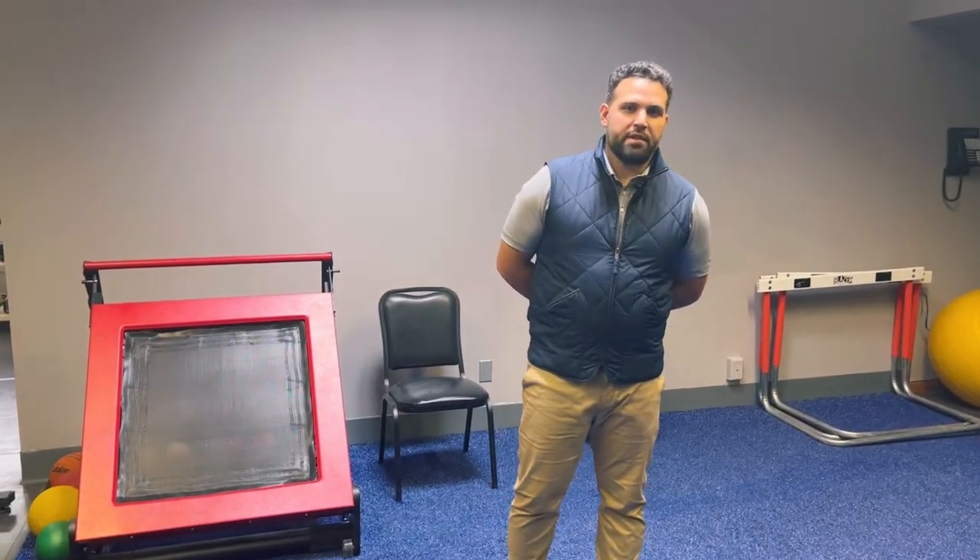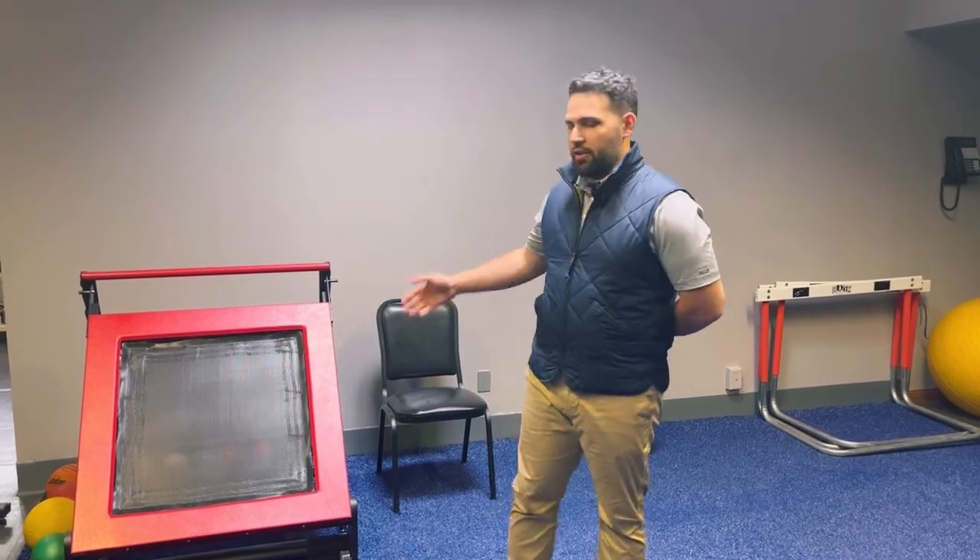Hey everyone, this is Bobby from Angela Rehab. Today I want to highlight one of our pieces of equipment that we have in our facility — our rebounder — and show you a few things we can use it for to help our patients. It really is a nice piece of equipment that we're very fortunate to have.